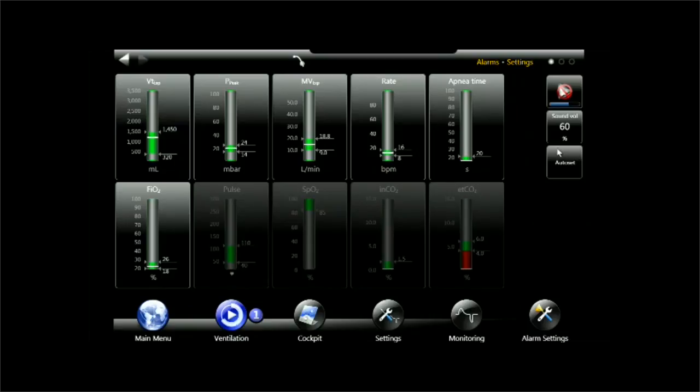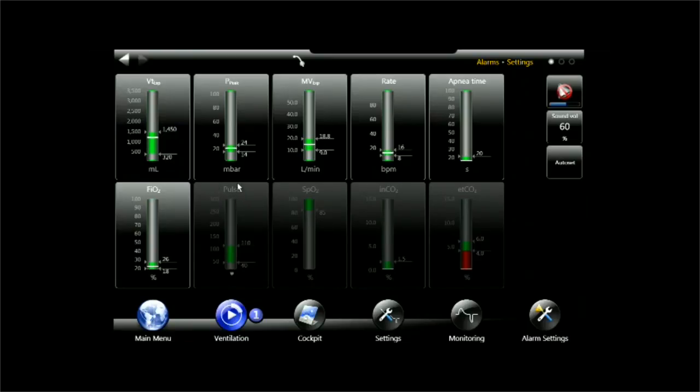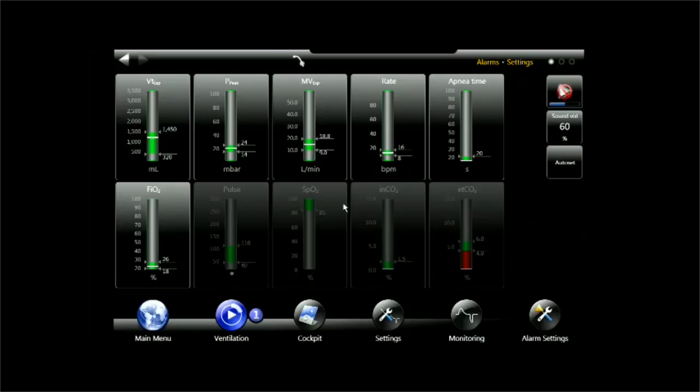We also see down here, we see optional alarms which is pulse, SPO2, these two come from the optional pulse oximeter and we see capnography alarms, inspired CO2 and end-tidal CO2 for which I can set alarm limits when the sensors are connected.